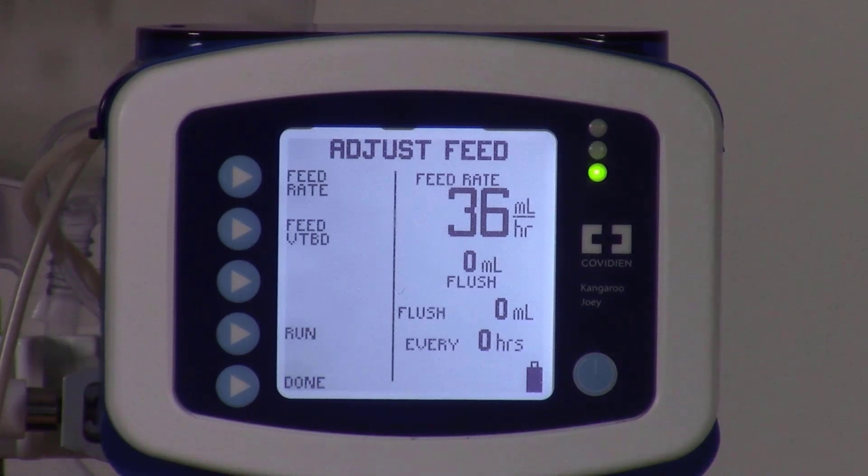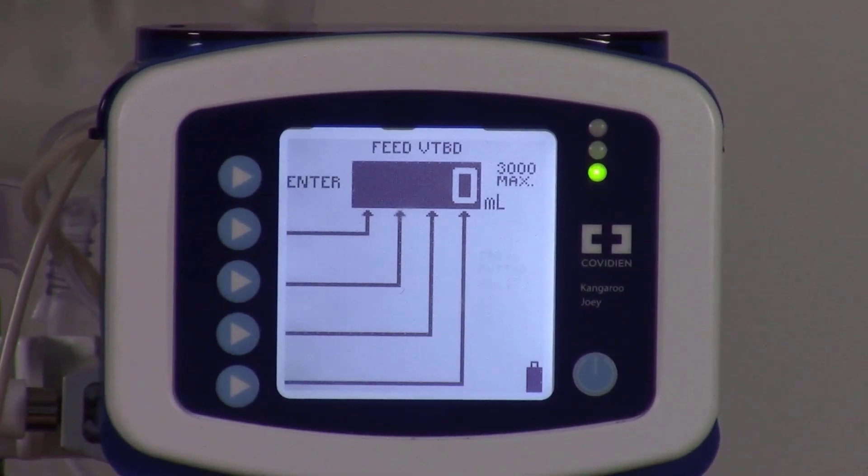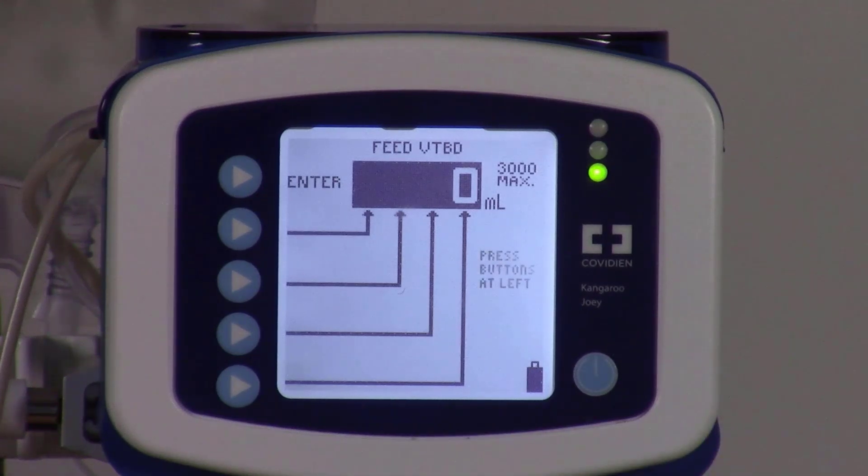Our next step is to look at the feed VTBD, which means volume to be delivered. We would like to ensure that it remains at 0 and that we do not enter a number into this screen. The reason is that if we were to enter a number, say 50, the pump will physically alarm every single time 50 milliliters of formula has been delivered. This can get annoying and confusing to patients.